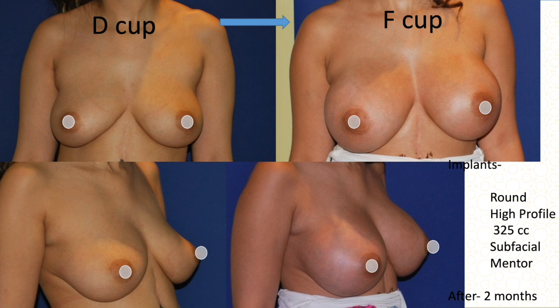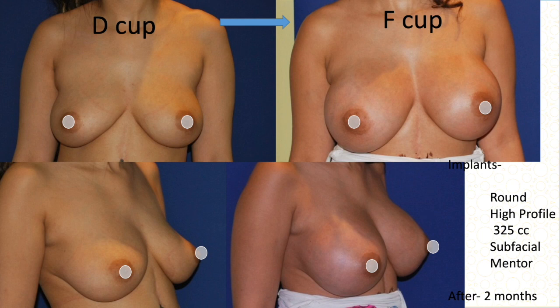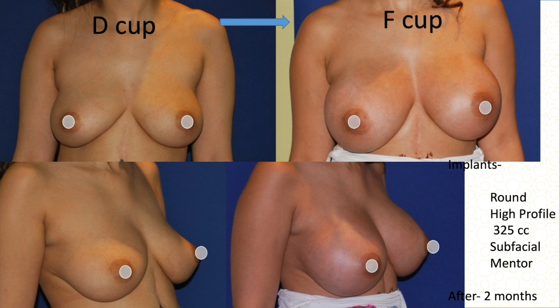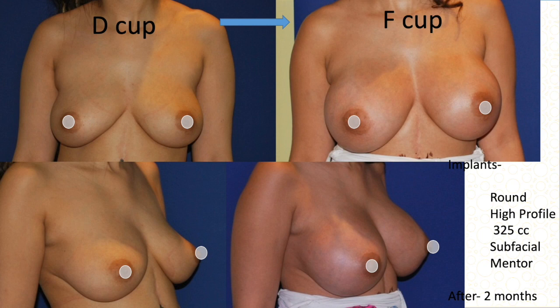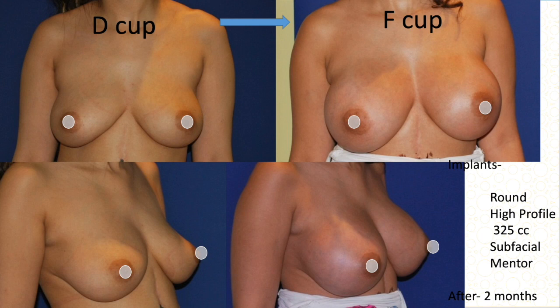Now this is already a D cup. Although anyone beyond C cup tends to have more sagging and would normally need a lift, there are intermediate patients who are just about D cup and do not want a lift — it is still possible to achieve some lift with an implant alone. For her, I used just a 325 cc implant to give fullness on the top part and some lift, but I warned her that in future, with weight changes or aging, she may still require a lift.